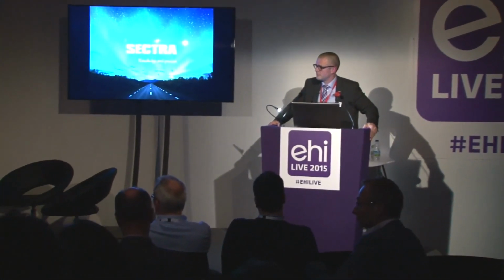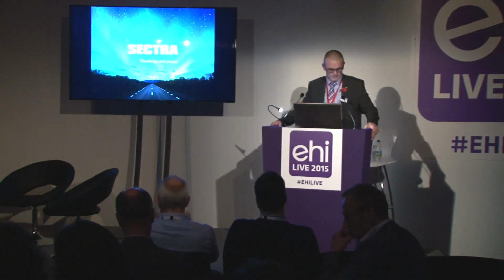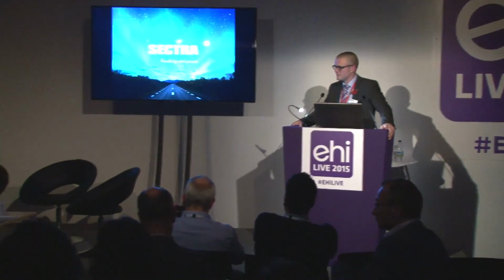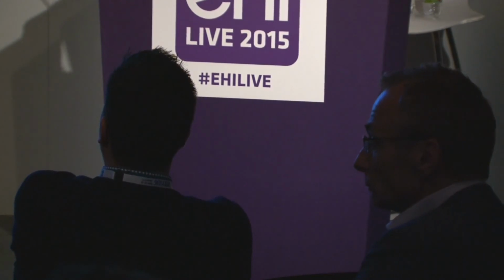Another major difference between pathology and radiology is that in radiology, digitisation has taken away quite a few process steps. So you no longer need to develop a film, you no longer need those toxic chemicals and all that ventilation apparatus that you used to have. You also speed up the process because you haven't got to wait for films to be processed and to dry. But in pathology, you still have to produce a slide just the way that you used to. It doesn't take away any process steps.